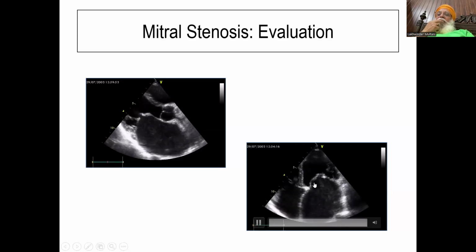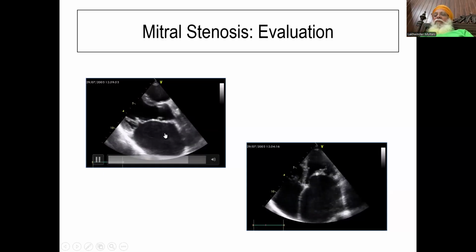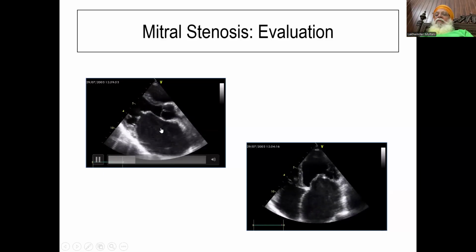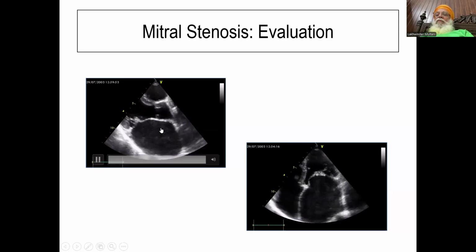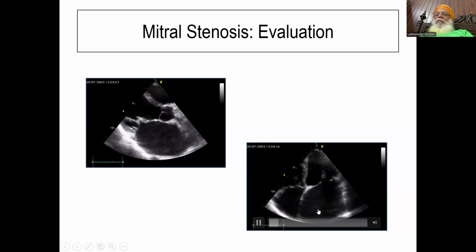And on the other hand, in four-chamber view, we hardly see any opening in this particular part of the view. And look at the LA size. LA size is large. If you have to measure this LA size, which we taught you over a period of time, this LA size is quite large in this subset of population, and so is over here.